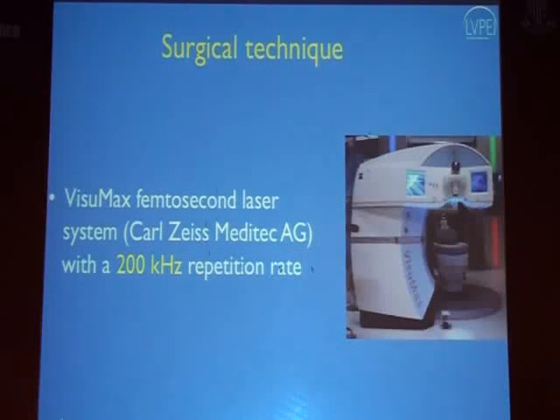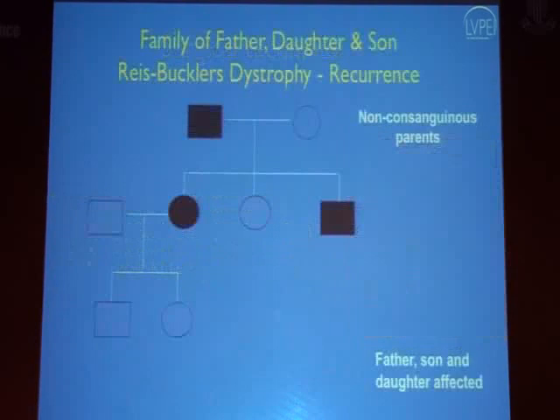So the machine that we have access to is the Visumax femtosecond laser system, which is an excellent system, but it doesn't give you any side profile. It's a straight-on side profile. And I'd like to just discuss a few cases using this technique.